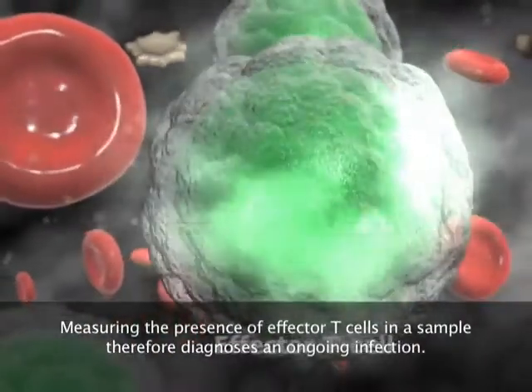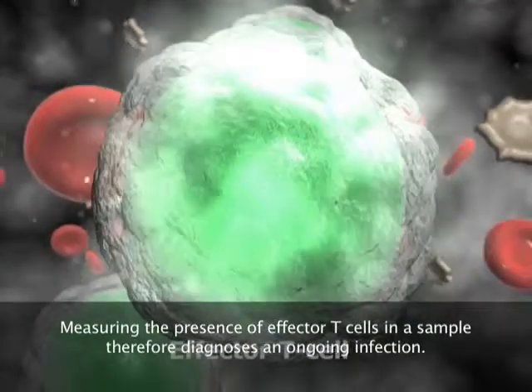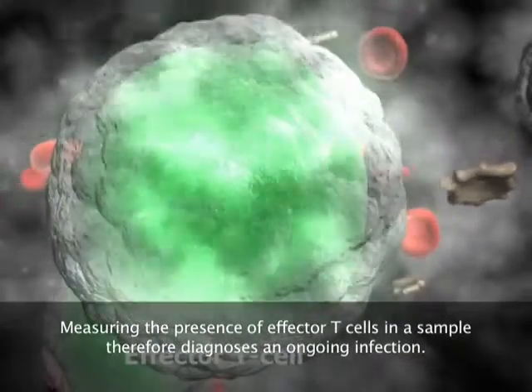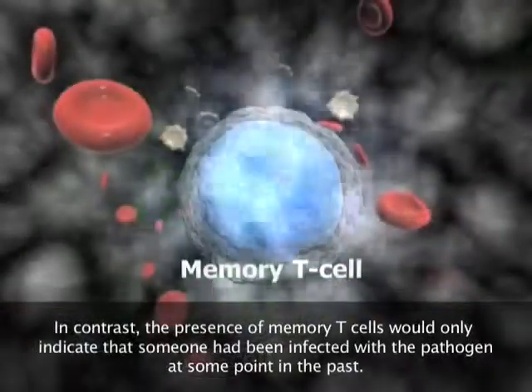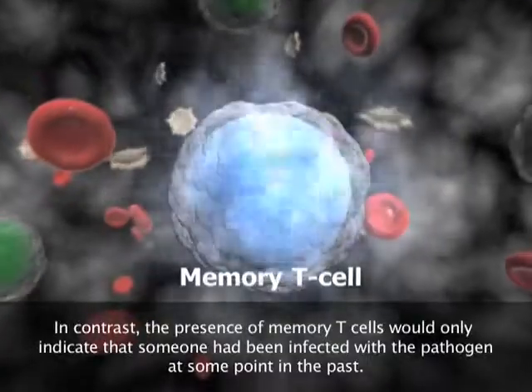Measuring the presence of effector T cells in a sample therefore diagnoses an ongoing infection. In contrast, the presence of memory T cells would only indicate that someone had been infected with a pathogen at some point in the past.